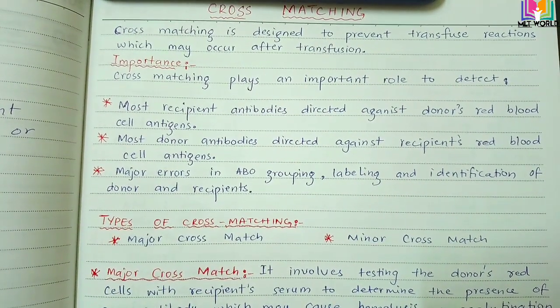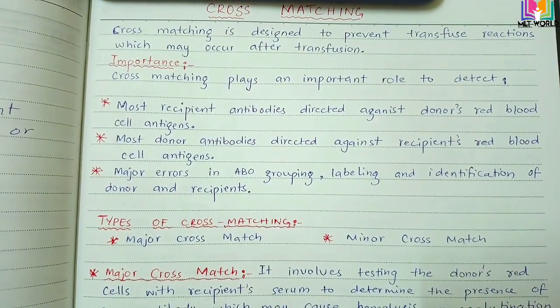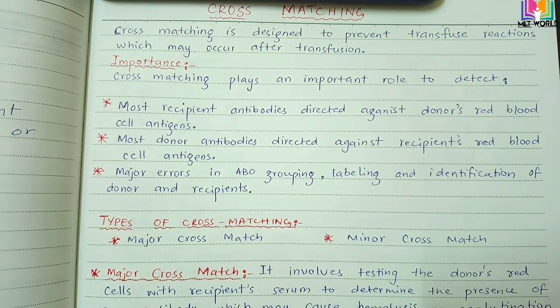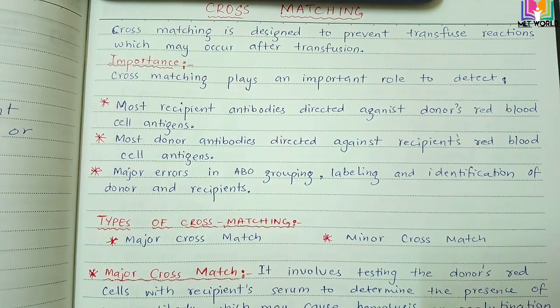Because if any transfusion reaction happens after transfusion, it is not only difficult to deal with but sometimes leads to the death of the patient. So cross matching is a very important test performed before transfusion.